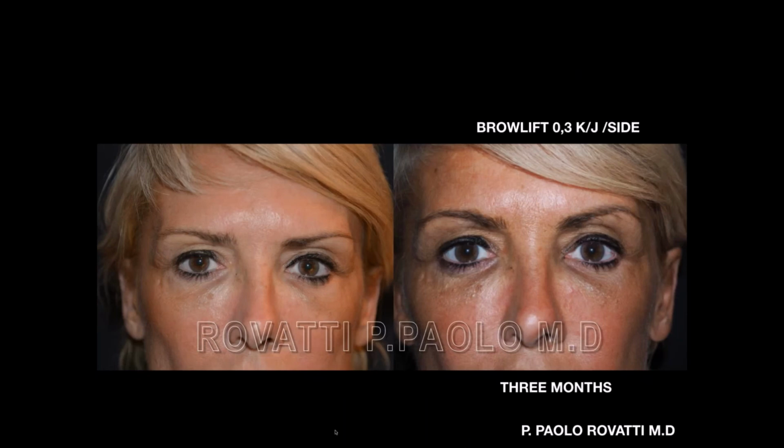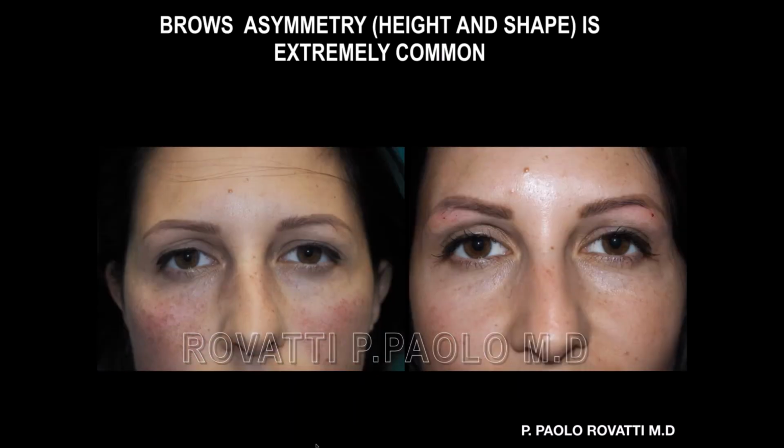This is a brow lift. You can see that there is less skin on the upper lid, on the right upper lid. And you can see even the asymmetry after the treatment, but you know, the height and shape of the brows are usually uneven, and the patients are not complaining about this one. But here, I don't know exactly what happened, but usually the right brow is higher, even if I treat with the same kilojoules, because usually I do the same from one side to the other. But look, on the right eye, on the upper lid, less skin on the eyelid.